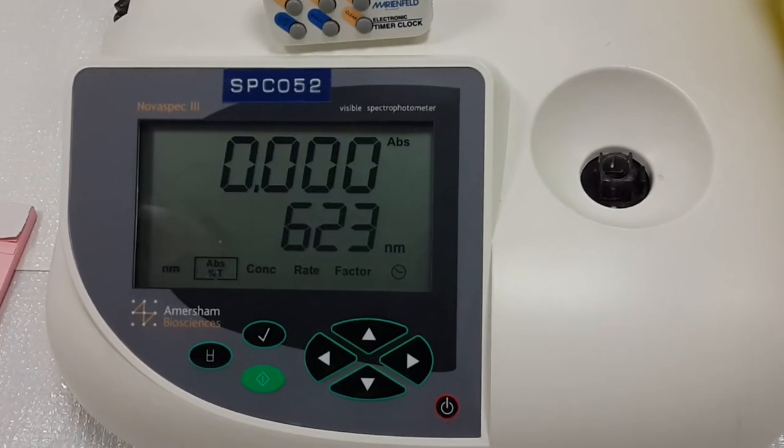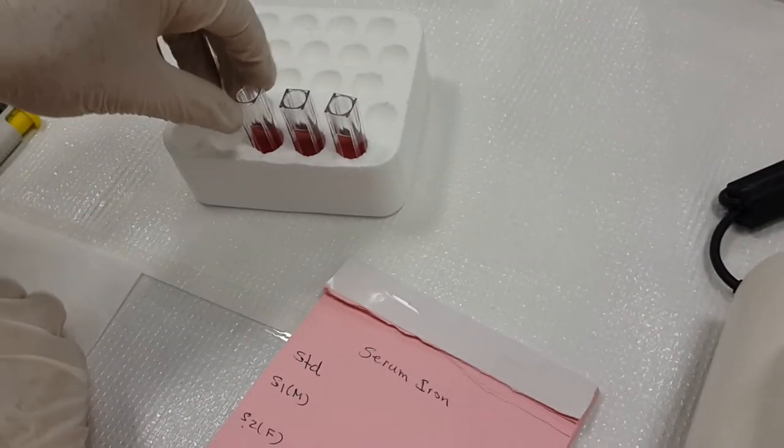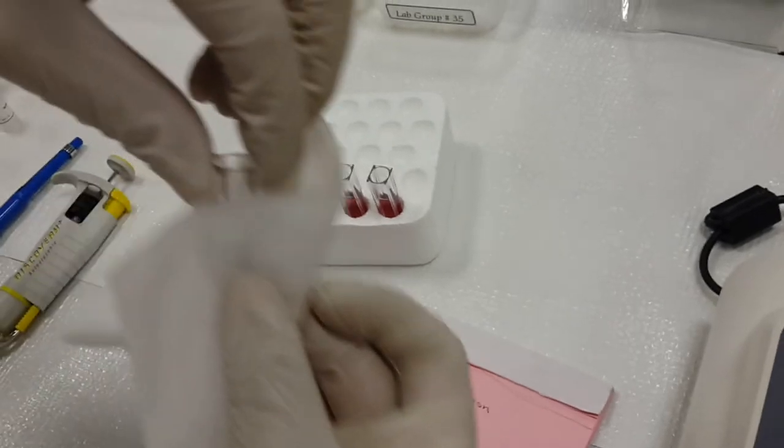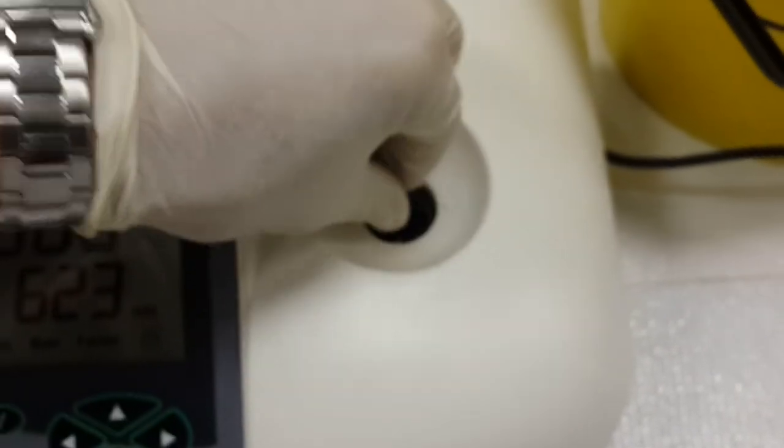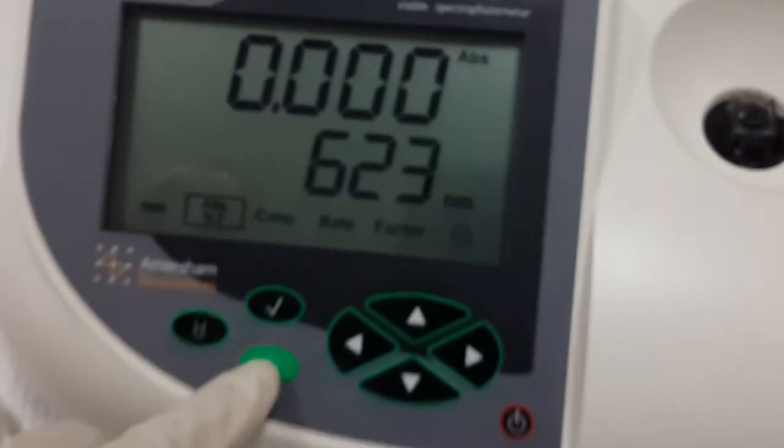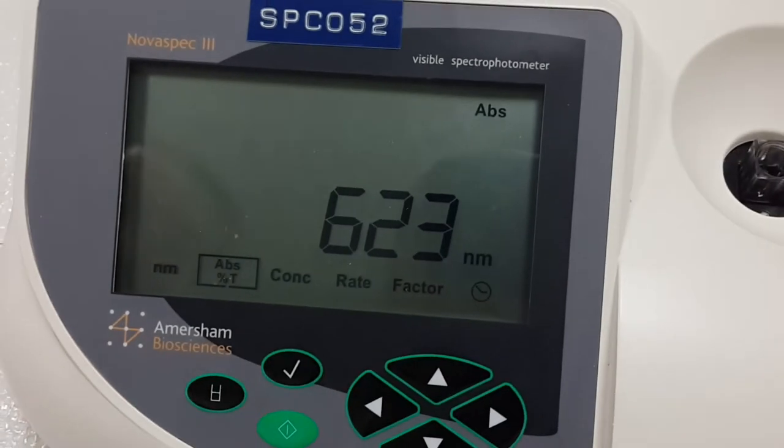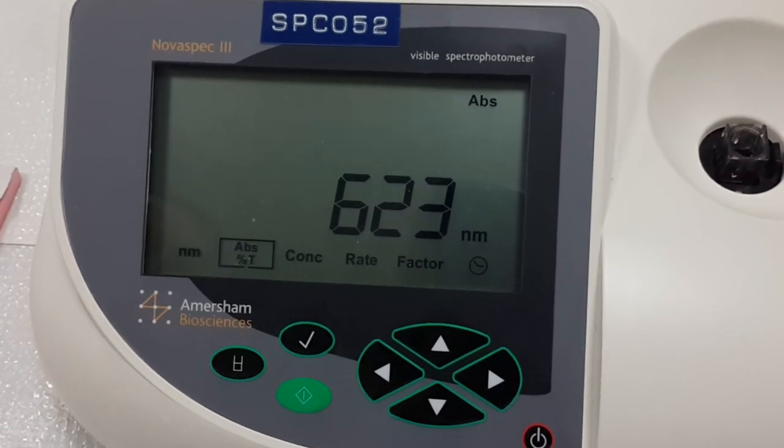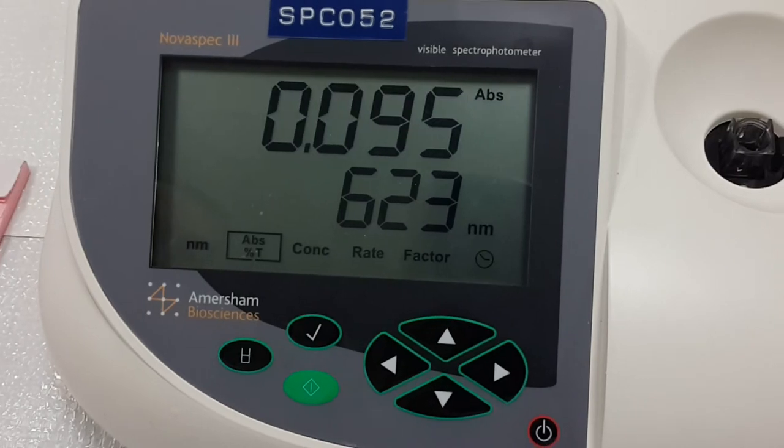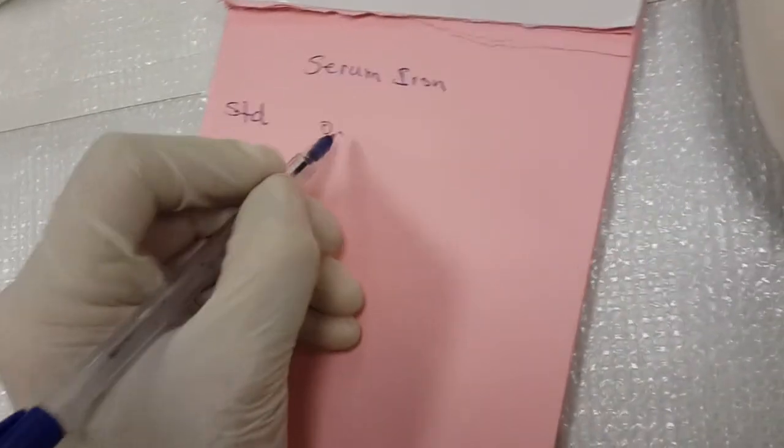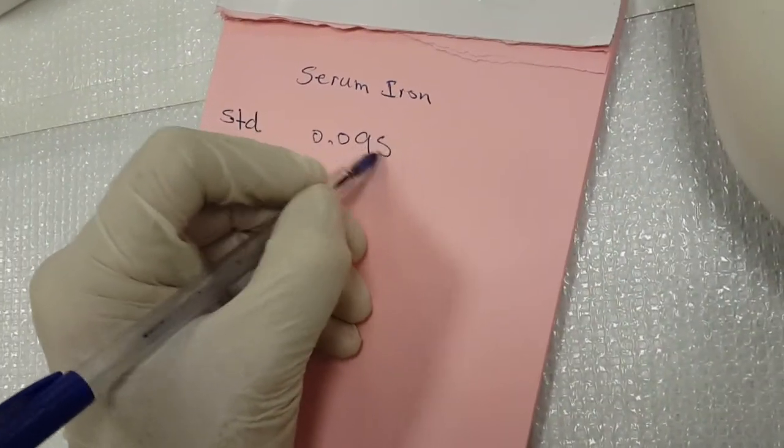It's ready. Remove this one, take the standard. The same thing, clean, put it inside, and push the green button and take the absorbance. It's 0.095.